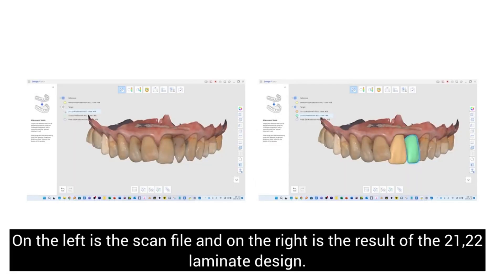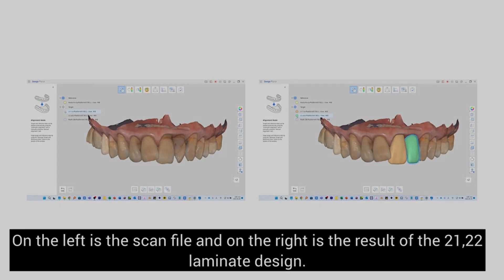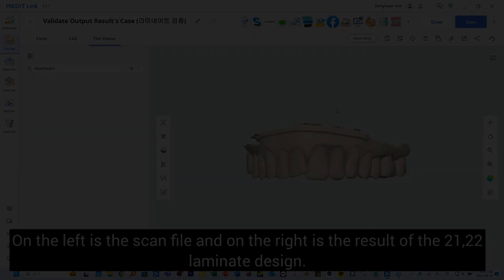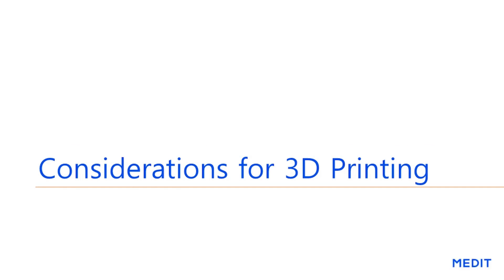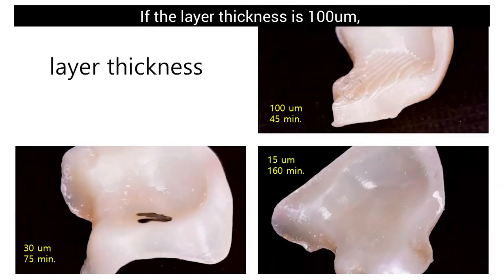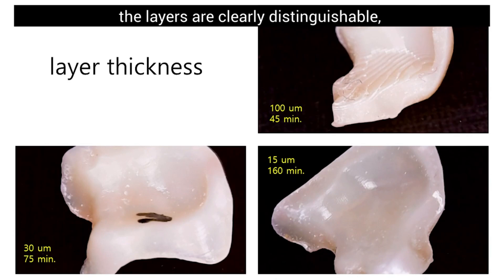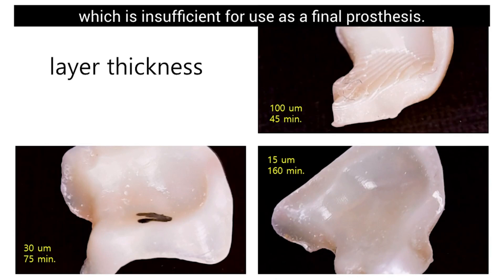On the left is the scan file and on the right is the result of 21 and 22 laminate design. Let's take a look at what you need to consider when outputting your designed laminate. If the layer thickness is 100 micrometers, the layers are clearly distinguishable which is insufficient for use as a final prosthesis.